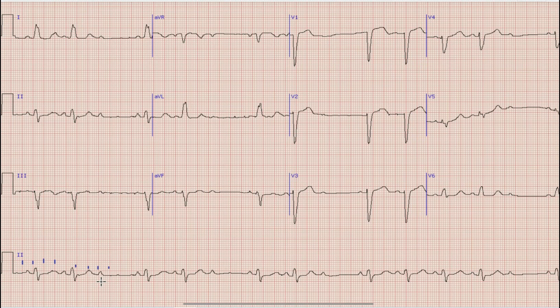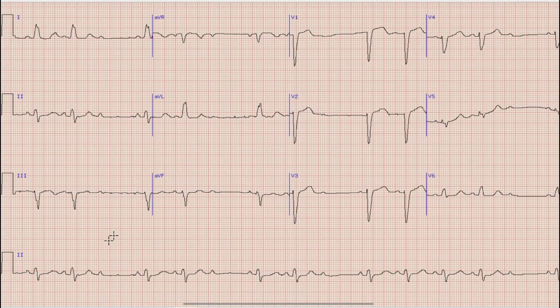For this P wave to be a premature atrial contraction it should come earlier than the normal P wave. But here we can see that the second P wave is almost at the same rate as compared to the previous two P waves. So we can say with certainty that this is not a premature atrial contraction — this is a normal sinus beat which is not being conducted to the ventricles.